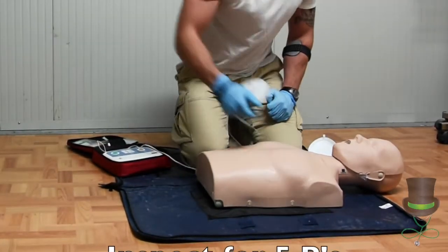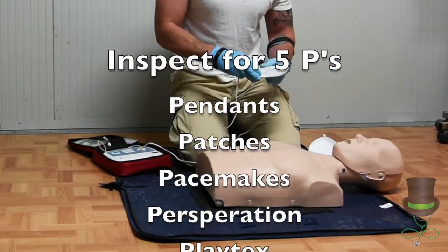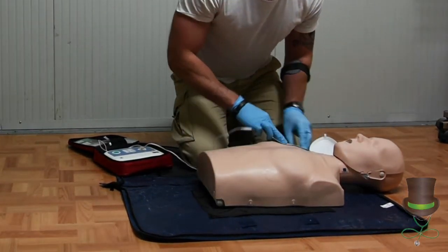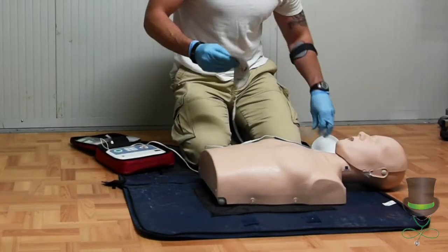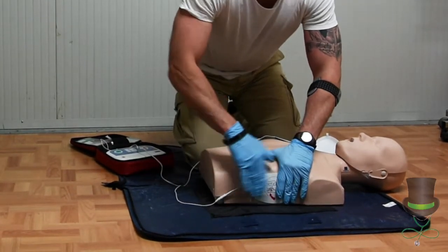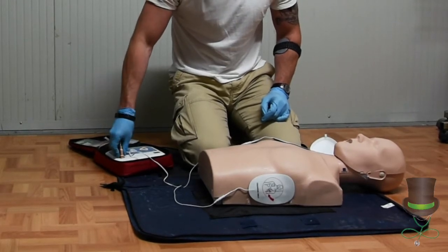Expose the chest, checking for pendants, patches, pacemakers, perspiration, any excessive hair. Look at the pictures and apply pads accordingly, to the mid clavicular region, and the mid axillary region, which is under the armpit. Plug in your AED.